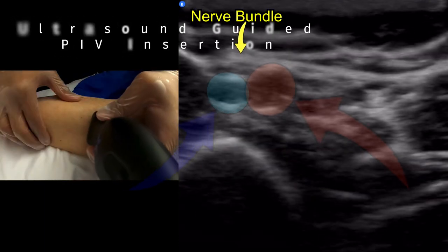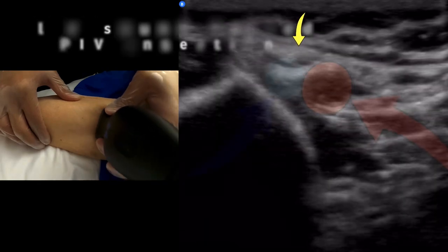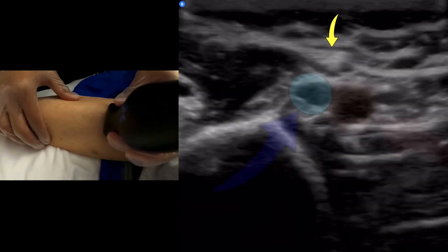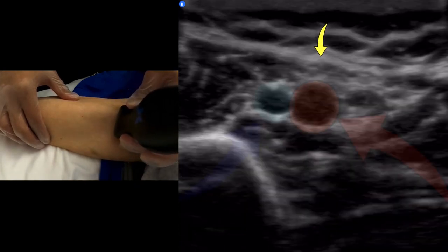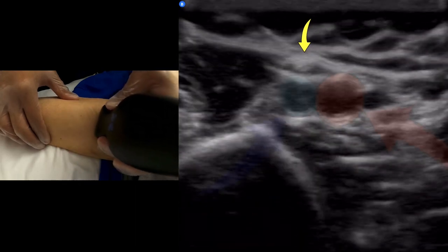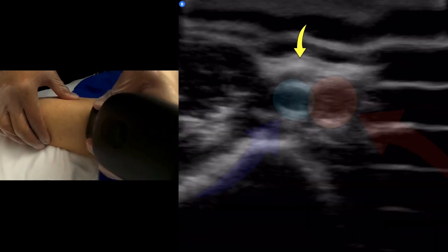So here I'm doing an ultrasound PIV, and as you can see in the red bubble, there is the non-compressible circular object, which is the artery, and then the easily compressible vein in the blue turquoise circle. And then the yellow arrow is actually pointing at the nerve bundle, which is a circular-ish object with a honeycomb-like appearance that is non-compressible, shiftable but not compressible.